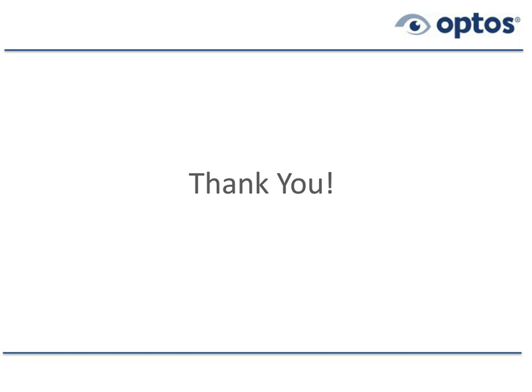That's great. Thanks. We have several questions here. One of the most popular questions is: is fundus autofluorescence a billable procedure? If so, what is the code? And can I bill both color fundus photos and AF photos on the same day?